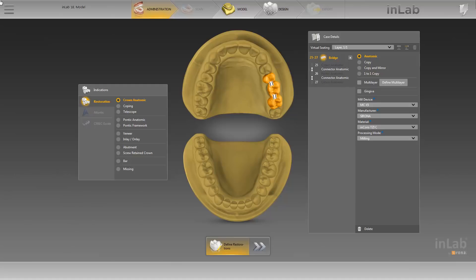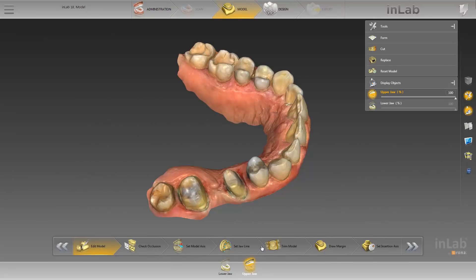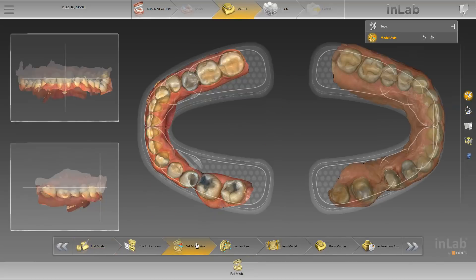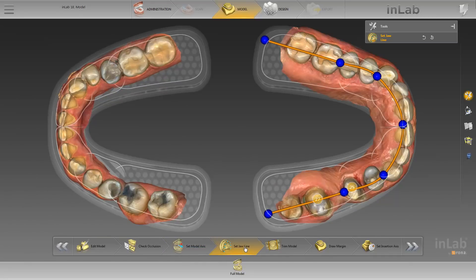Therefore, we will switch directly to the model phase by clicking on the double arrow. In the model phase, we will first define the model axis. For this, we will use the recommended standard procedure and align the 3D model optimally in the occlusal, buccal, and mesial view. Then we will move to the next step, set jawline. In this step, we align the jawline using the blue dots.